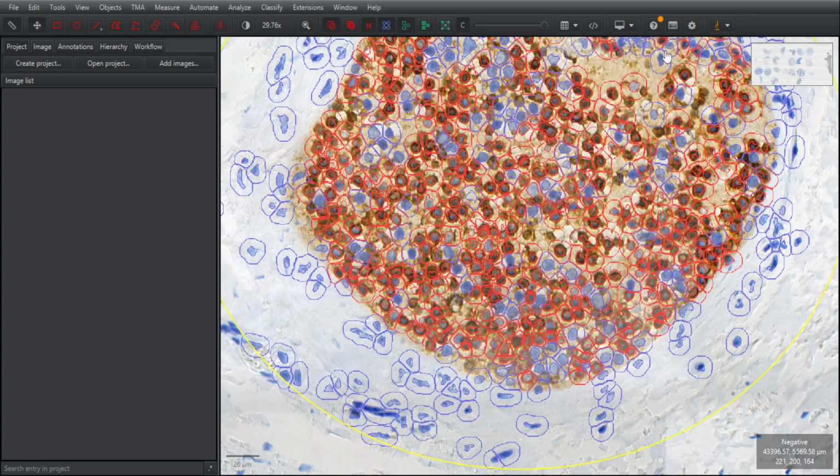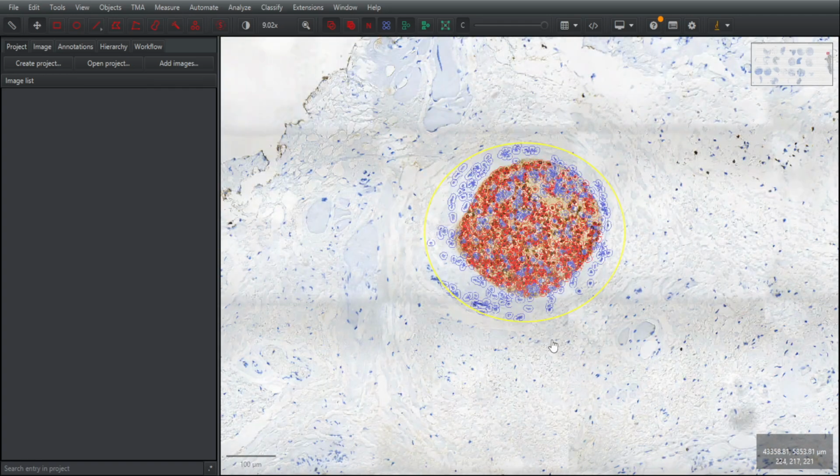And afterwards, when you are working on the complete database or complete image, you can standardize it. I would say you can standardize using ANOVA or t-test or anything like that. So the number of negative is the tumor cells, and number of positive is the CD3 cells.